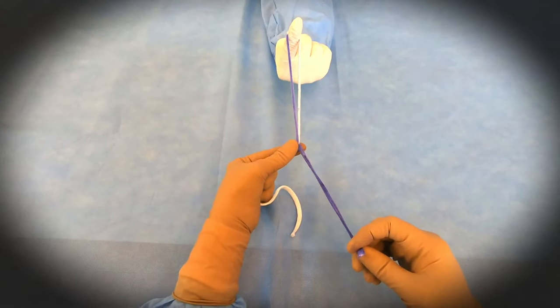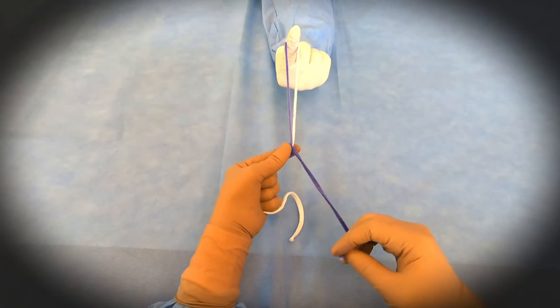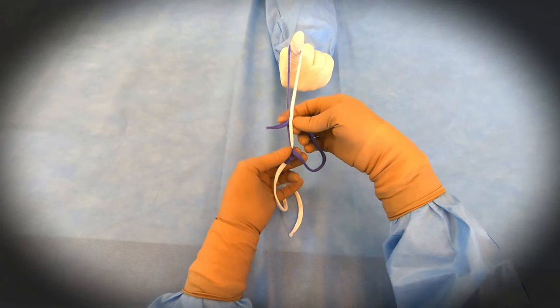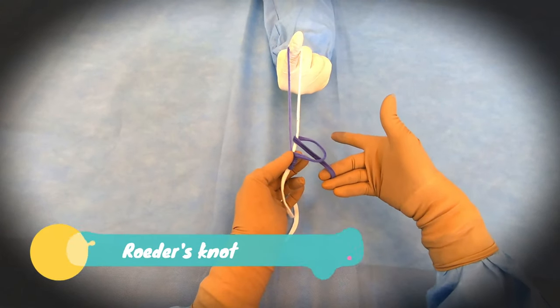Then you have the third wind, so three winds will be taken. After that you will take one half knot on one side of the limb — that is the right side — and it is done. This is Roeder's knot.